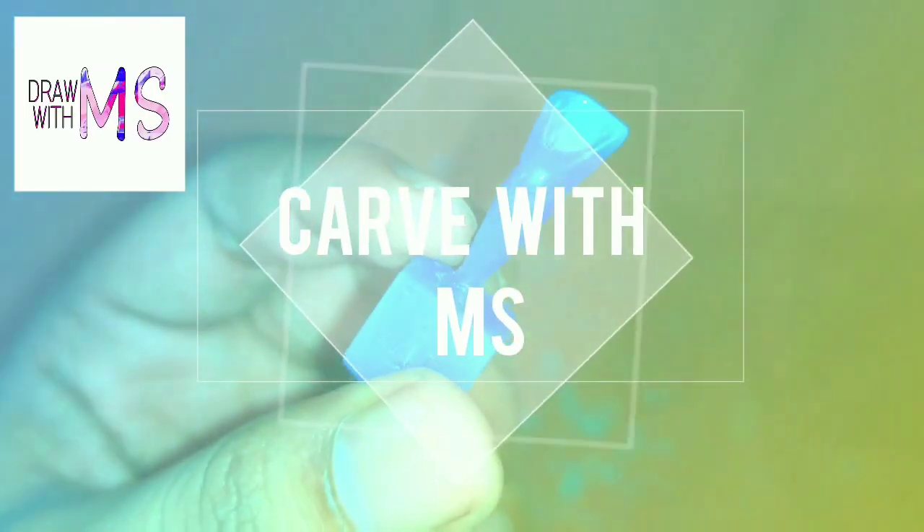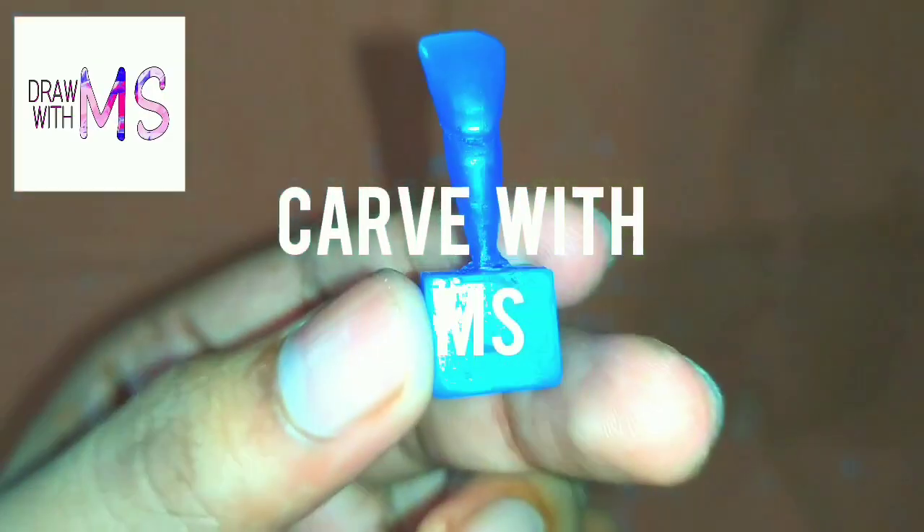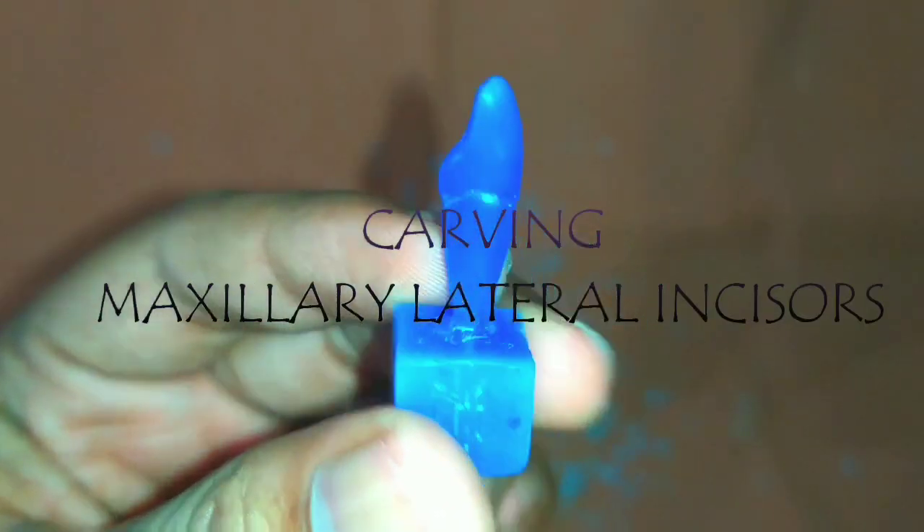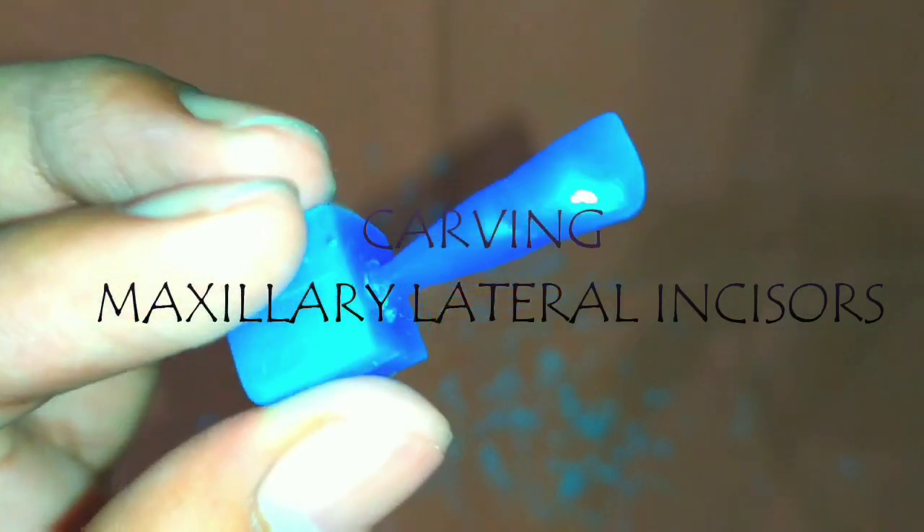Hello everybody, welcome to my YouTube channel. Today we are going to carve a maxillary lateral incisor, so let's start.